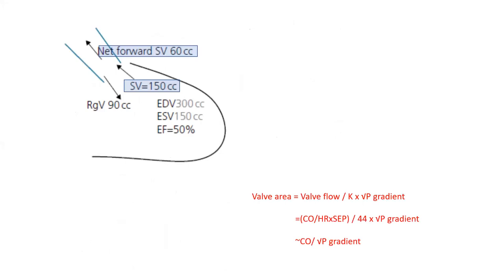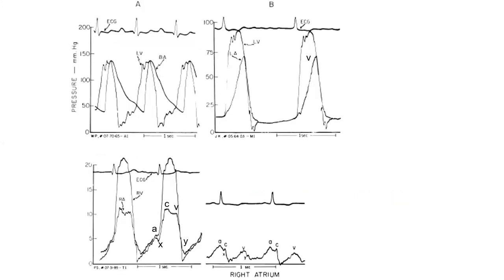Here are more summary tracings. In this LV-brachial artery tracing, there is no AS, but the brachial artery touches the LV in diastole — diastasis again — with no dicrotic notch and a massively wide pulse pressure. This is likely chronic decompensated AI rather than acute AI, given the significantly widened pulse pressure. These features confirm severe, massive AI.